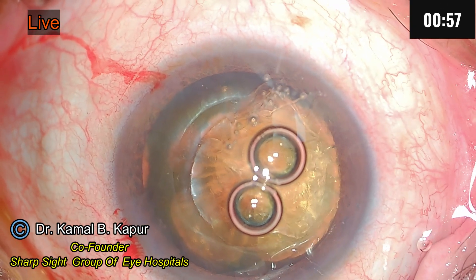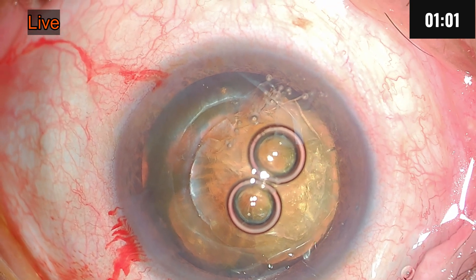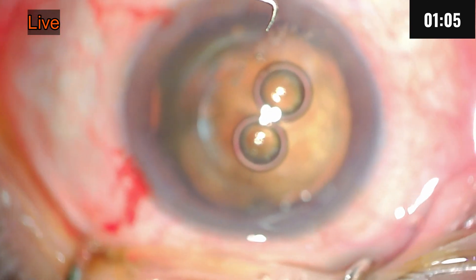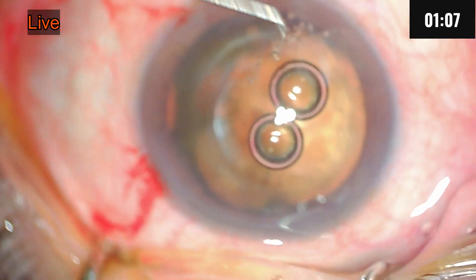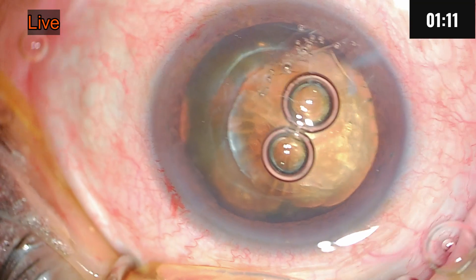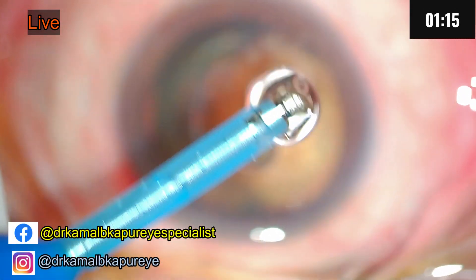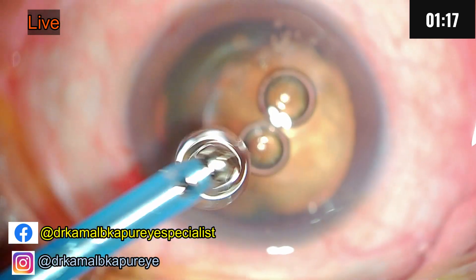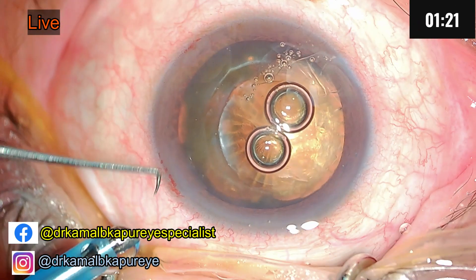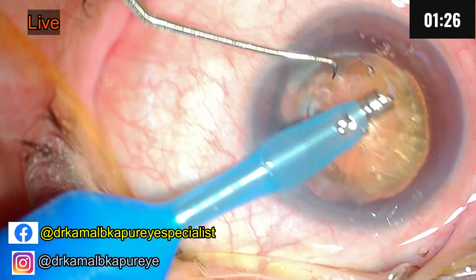FECO 60. Now I'll use a special chopper for this — I call this the Parshuram chopper. It's a very long flank chopper; this will help me. And another thing you need to do is you need to have more tip exposure for operating such a cataract. Now lift the corneal wound as you go in.